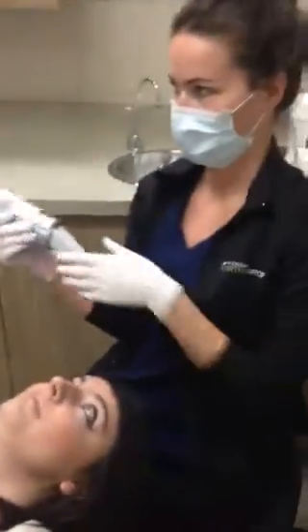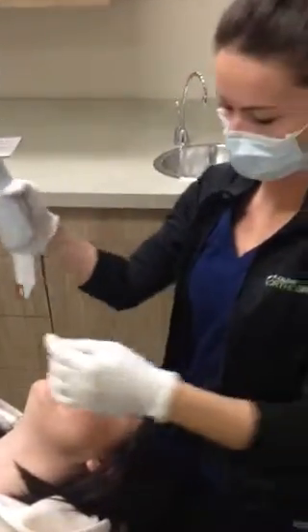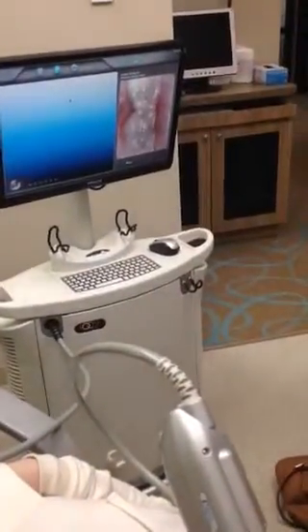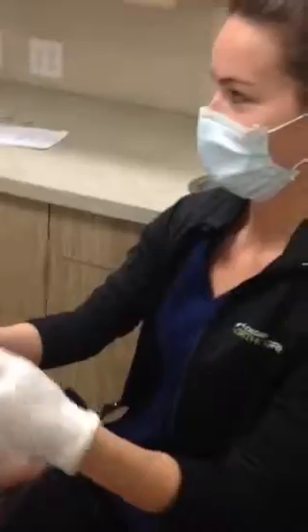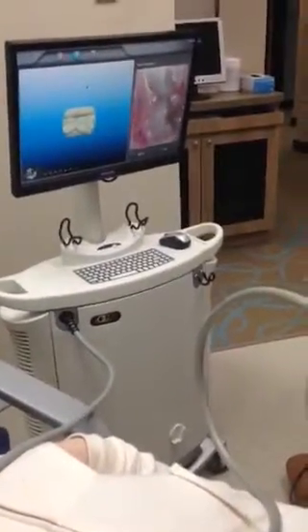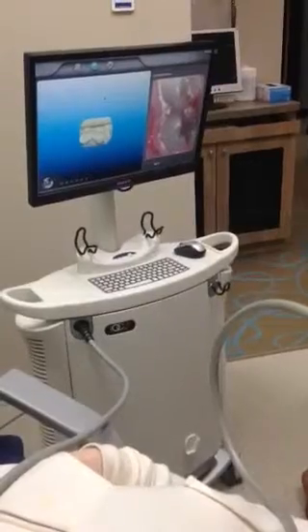Alright, so the computer actually kind of tells me where I'm going in the mouth. So it says lower left buccal, so I'll get you to open it super wide. And it's operated by foot pedals down here. So I just kind of press that foot pedal, wait for it to beep, and that means it takes the picture. There's an awesome voice in there telling me where to go next. And then you just kind of slide it over to the lower left buccal.